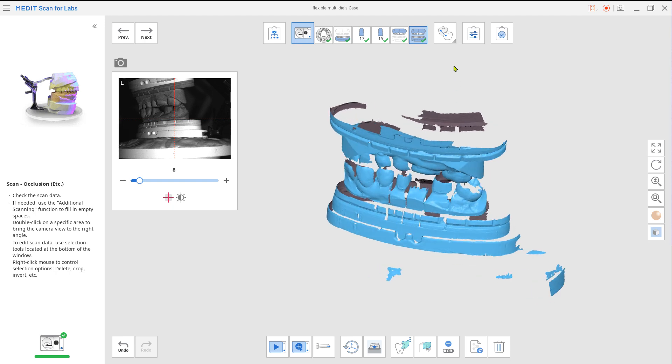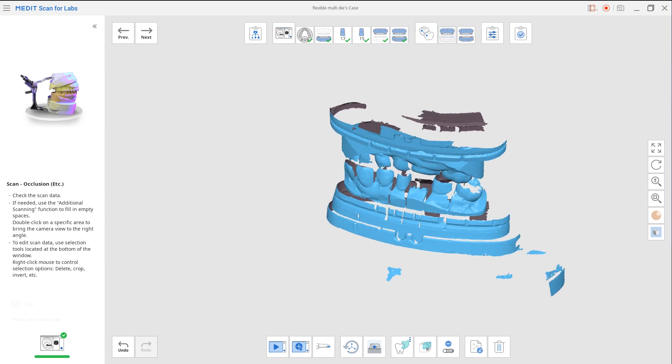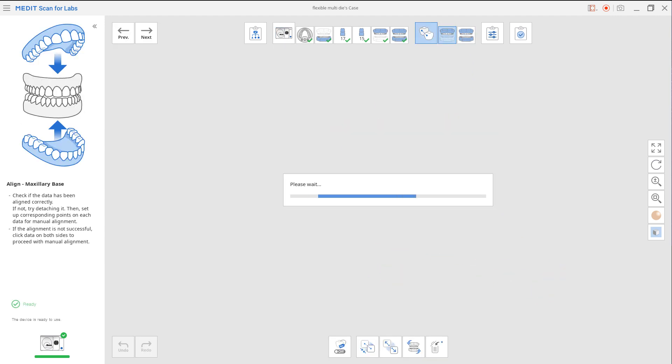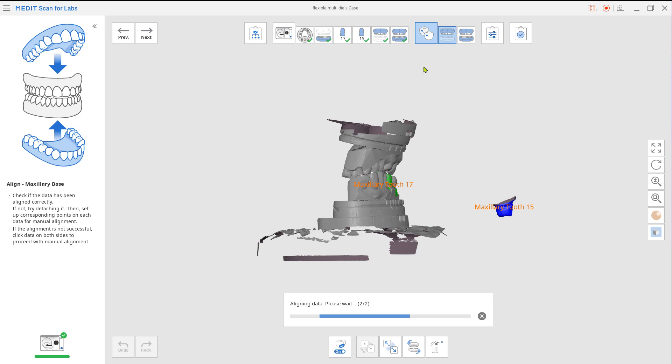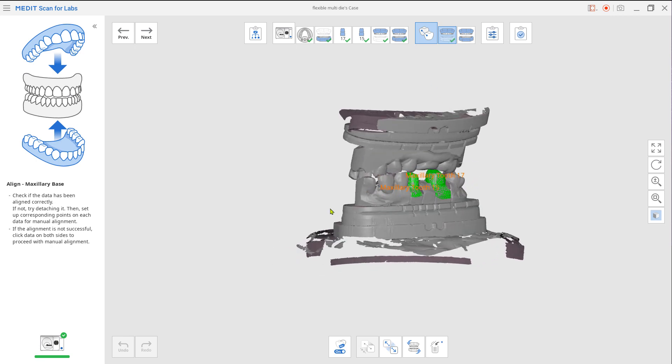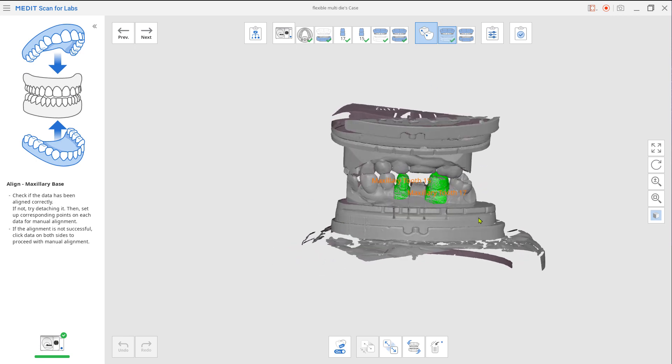Now let's go to the alignment. Go to Align Data and click Maxilla Base. The system will automatically assign prepped teeth to the maxilla base. If not, you can always click and match data manually.